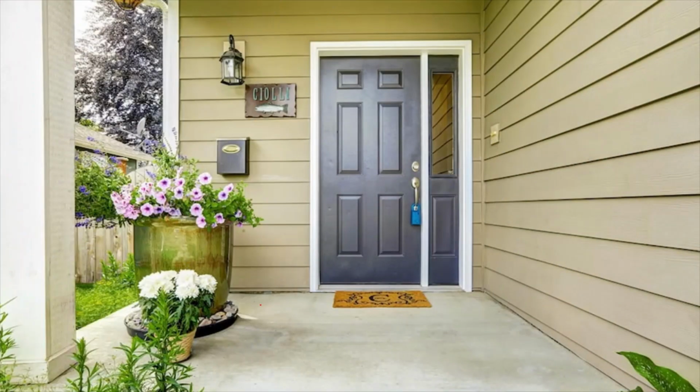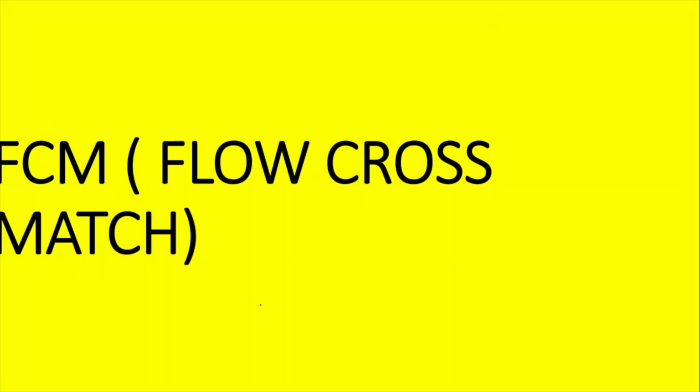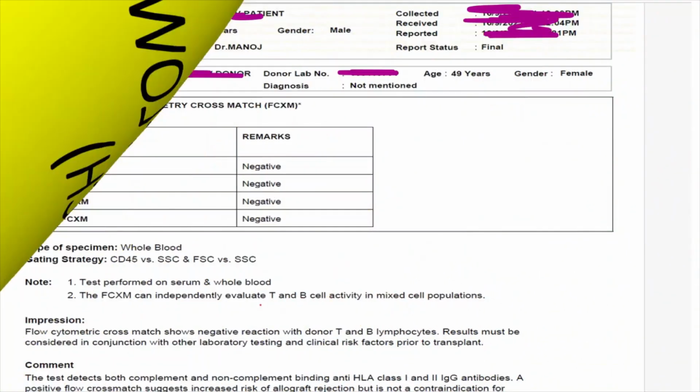Now we are going into the second room, which is flow cross match. What is the role of this flow cross match? This is somewhat more sensitive, or we are giving a double protection since we are going to do a major tissue transplant from the donor to the recipient. We want to be double sure that no antibody in the recipient is there to attack the kidney. So the second test is flow cross match.